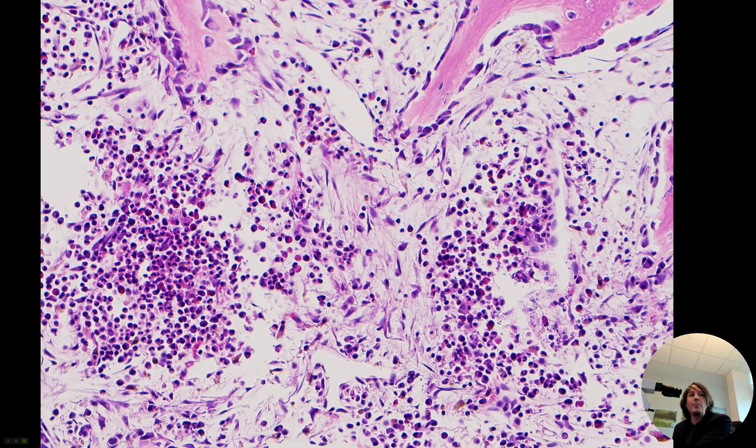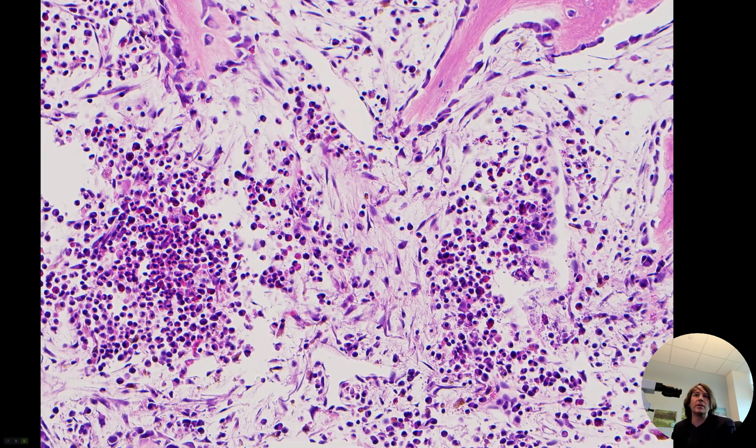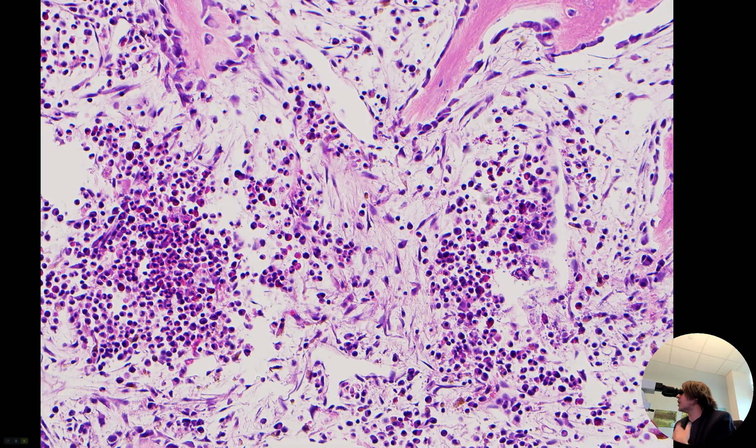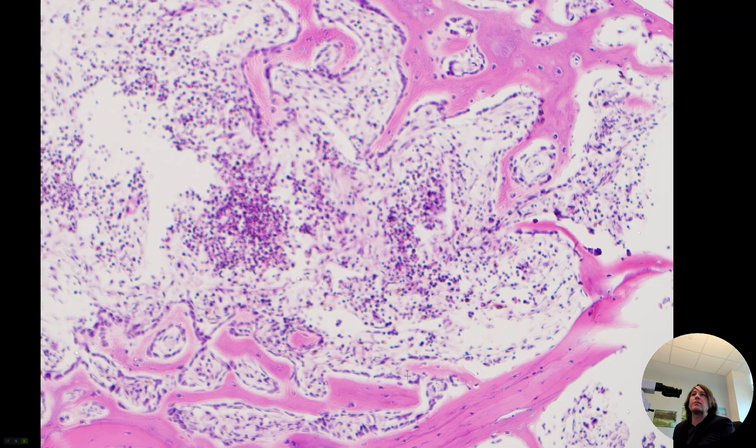There may also be a little bit of inflammation — inflammatory cells mixed in there. Sometimes it's hard to tell bone marrow elements from actual inflammation when a fracture happens. And here we've got reactive fibroblasts and myofibroblasts. So all of this process is basically the bone repairing — the person probably has a little osteoporosis, then they got a compression fracture of the spine, and then the bone is trying to repair itself.